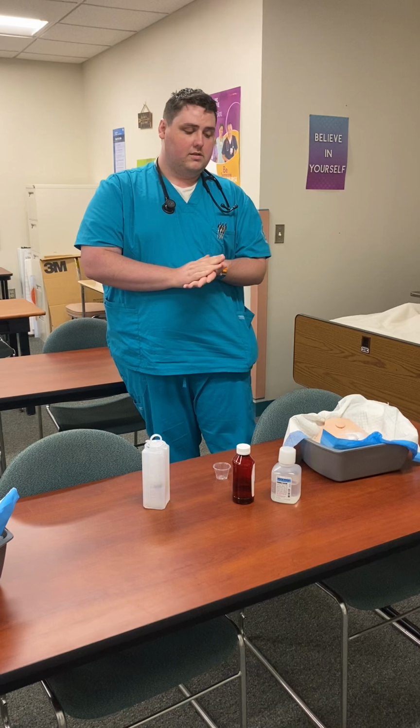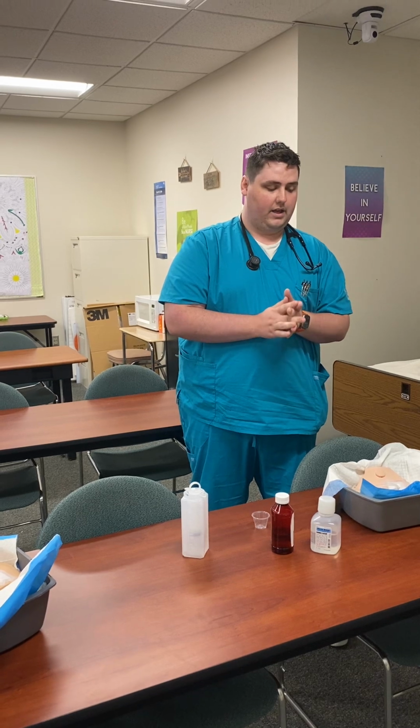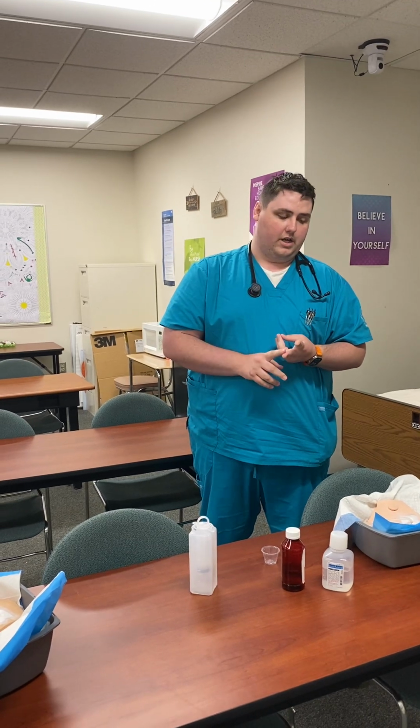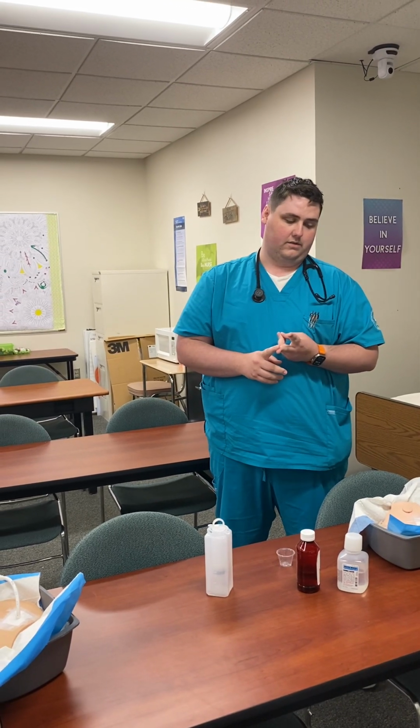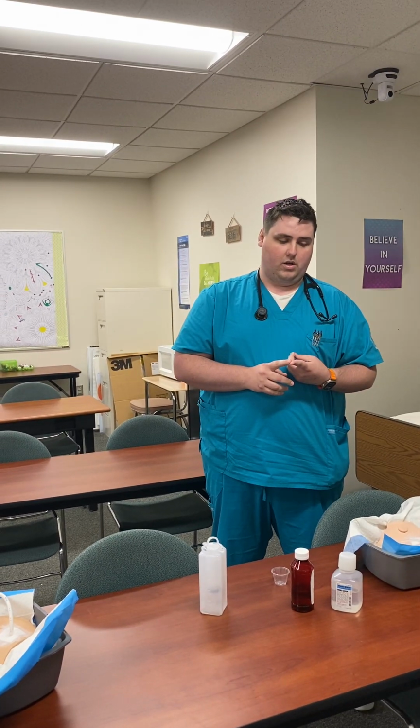So for PEG meds, first thing you have to look at is placement. So you're going to verify that your PEG tube is in the correct place. You can do this in two ways. You can inject air and listen for bubbles inside the stomach to ensure that you're there, or you can also extract some gastrointestinal fluids and test for pH. Today we're going to do the air method.